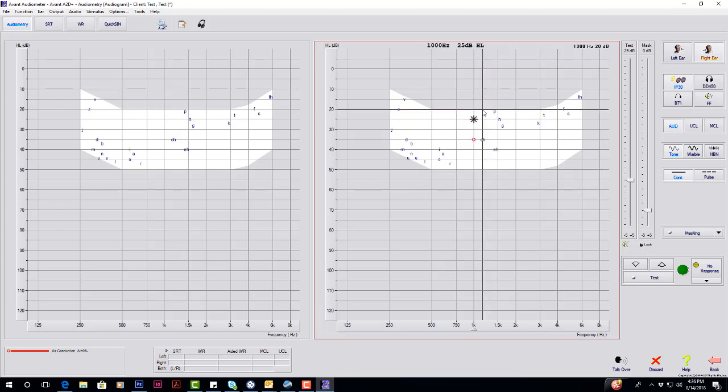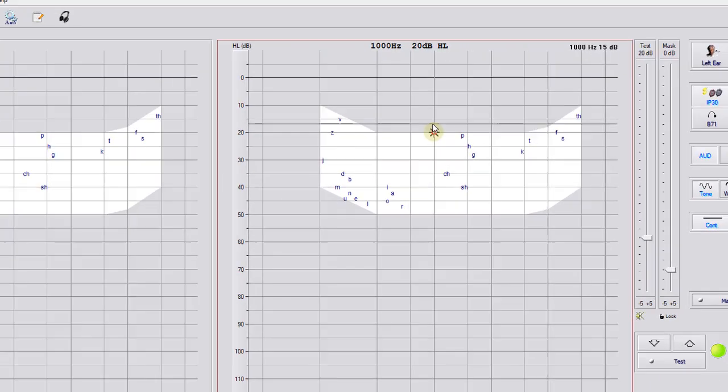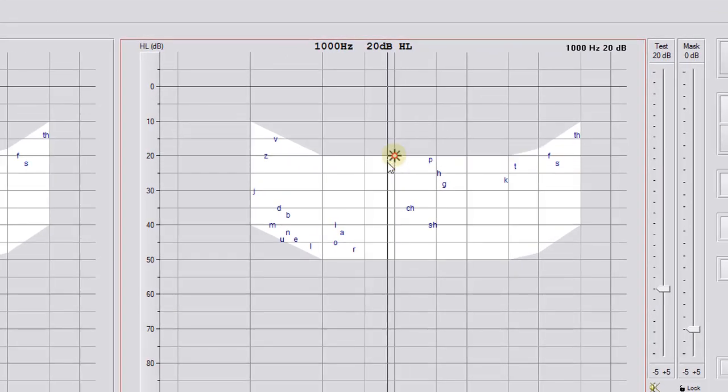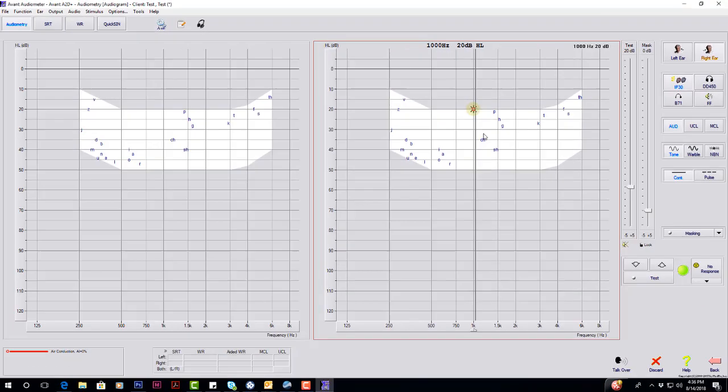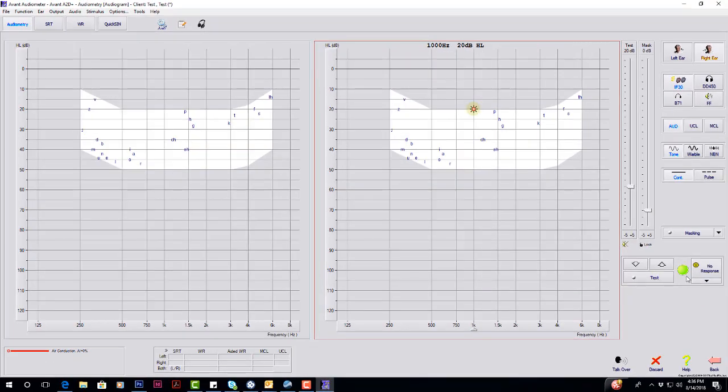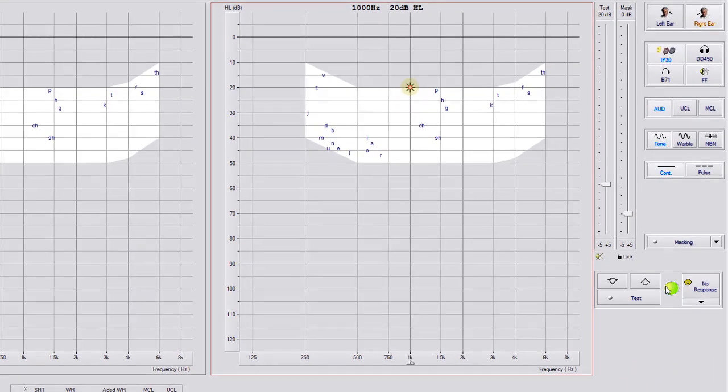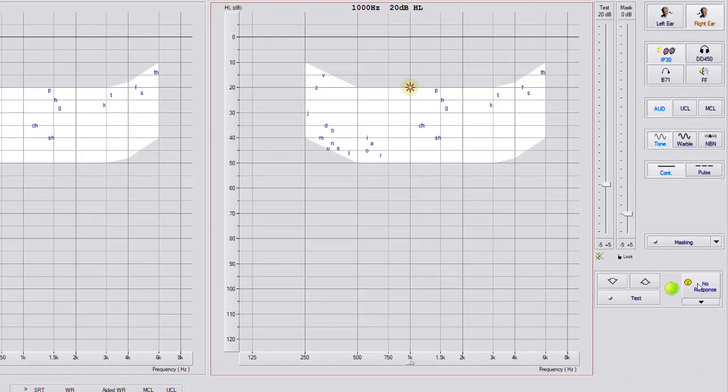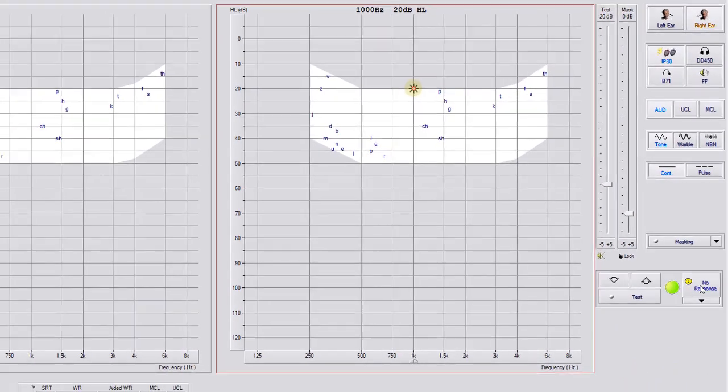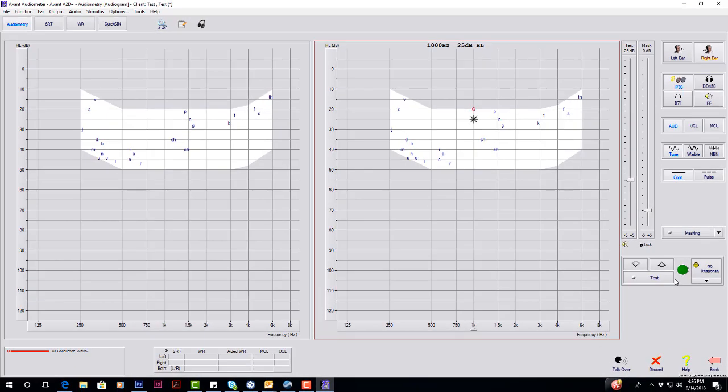Anytime the patient hears the tone, they press the patient response button. You'll get a lime green circle around your marker, and there's also a lime green indicator light down here next to your no response. This is not saving anything; it's just an indicator light.